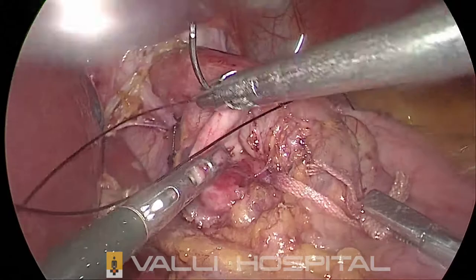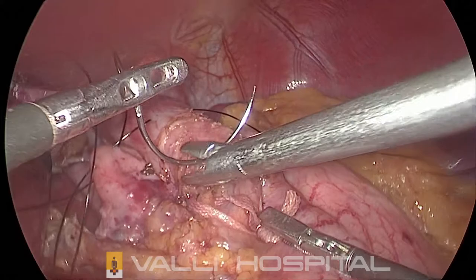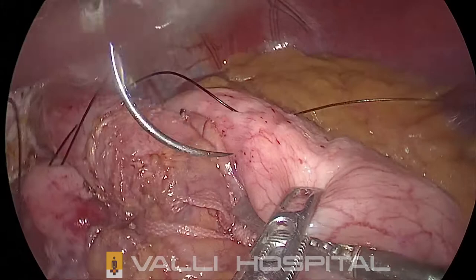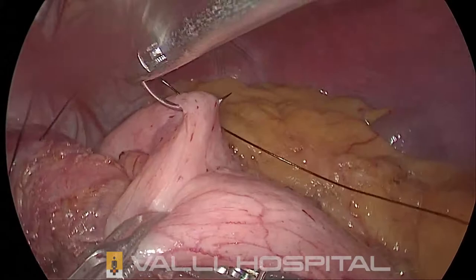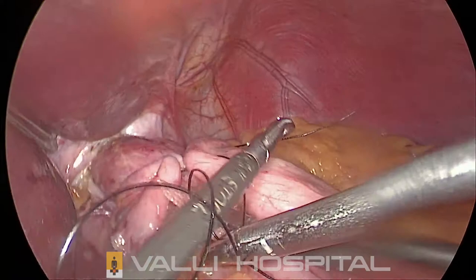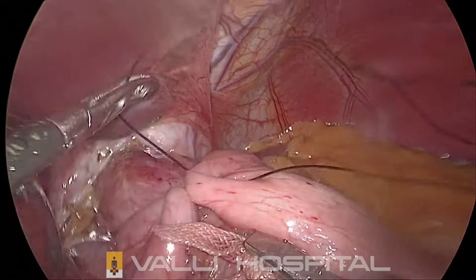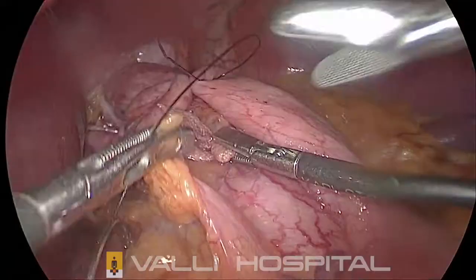Our idea is to create a short floppy Nissen. It has to be short and it has to be floppy. It must be less than 2 cm, maximum 2.5 cm. See, I am going closer to the previous bite. Put a surgeon's knot. Just approximate.